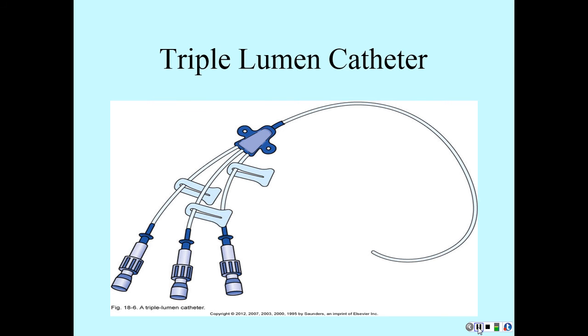If you are taking a central line out, you always want to look at the end of the catheter, just like you do your IV catheters, and make sure that the end is intact. It should be intact. They told you that when they taught you about taking IVs out. Look at it. If it's an IV catheter and all that comes out is that, where's the rest of it? But central lines, you really want to make sure of that as well.